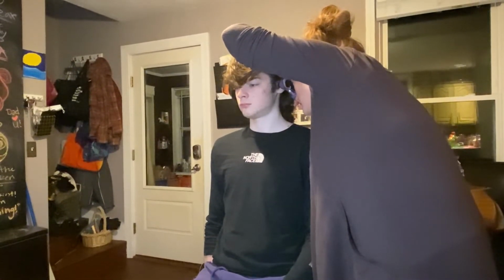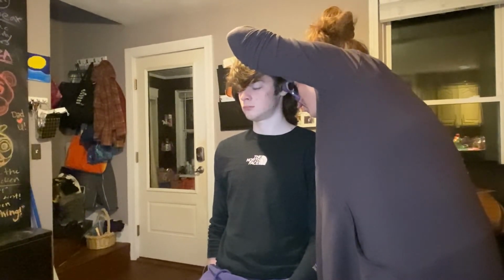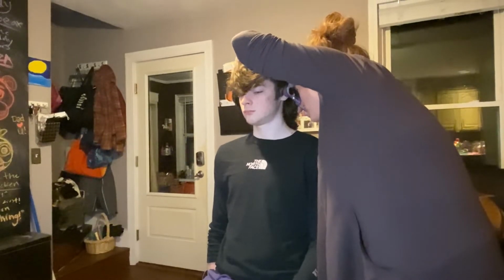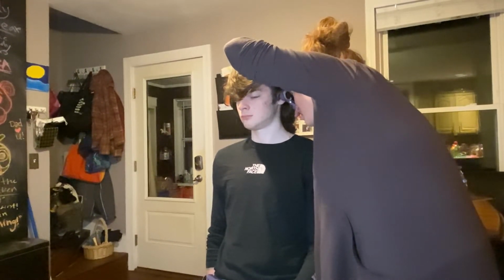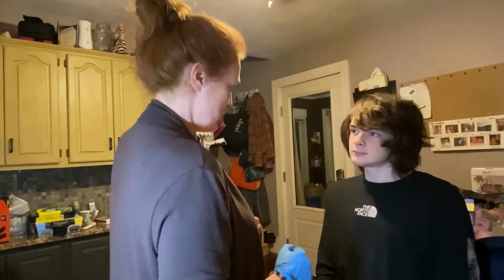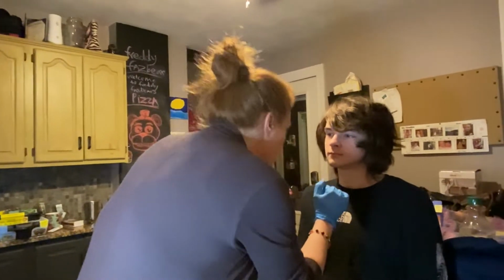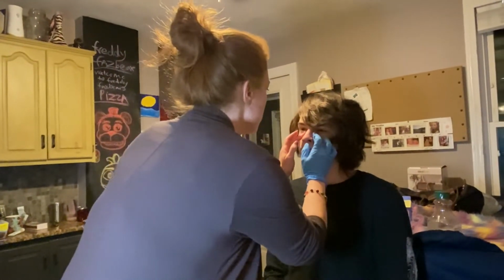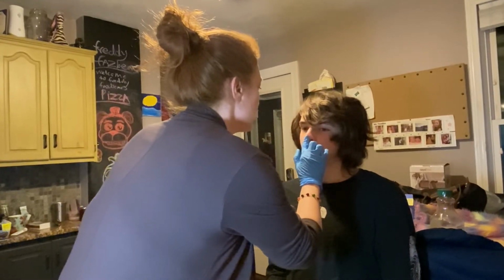Ear is pearly gray. No bulging. Appropriate location of cone of light. All looks good. Next, I'm going to inspect your nose. It is symmetrical. There's no drainage, no redness, no lesions. Tell me if anything hurts when I touch. No. Go down here. Great.